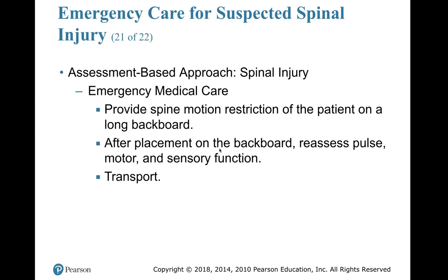Some companies have gotten away from the use of spine boards unless they absolutely need them to move patients with injuries. I will tell you that I am a firm believer in the scoop stretcher. It is easy to get into hard to reach places, and once it's assembled on the patient, it is just like a long backboard.